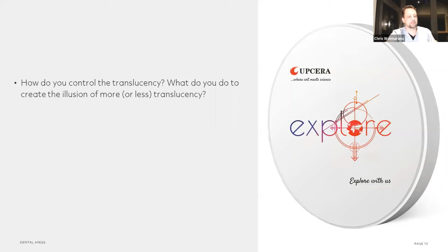It's been absolutely fantastic. Less work, not less work. Wow. But you're saying micro layering and even normal layering is still possible? It's always an option. Most of the time when we do micro layering now for this, it's more about doing a shape correction rather than changing the color.